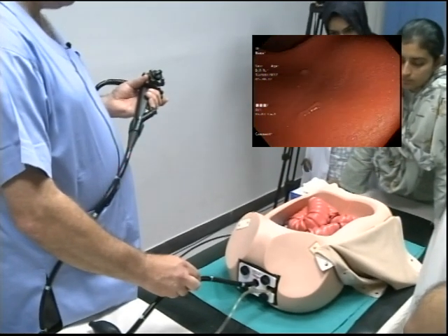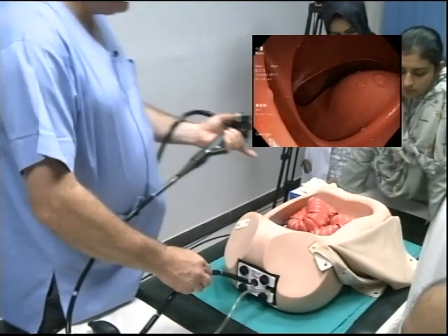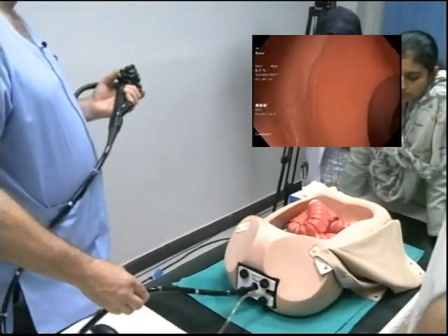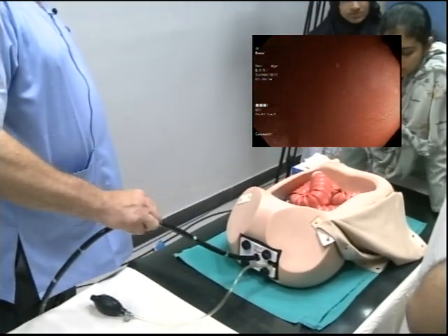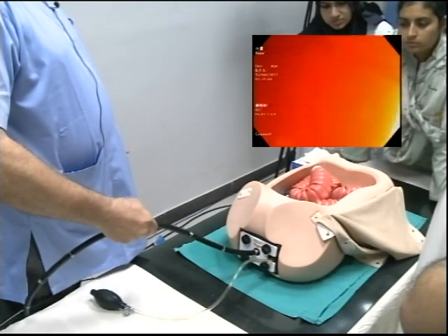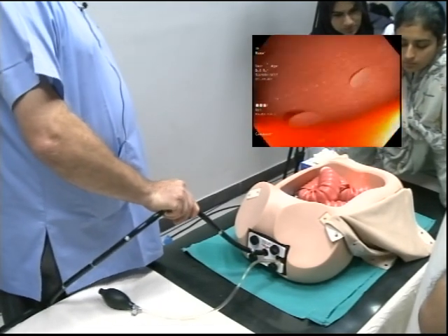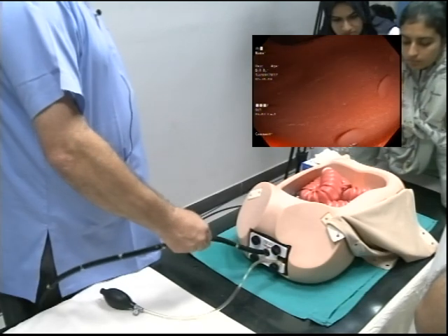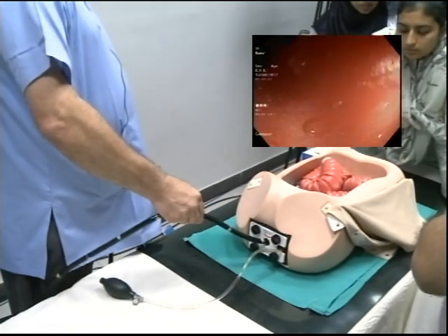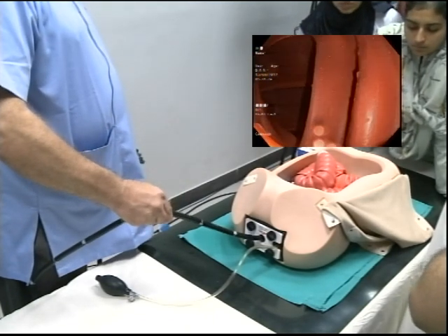If you look, see there now? Watch the scope. See it? It starts to knuckle out there, and then it starts to come here, and look at the scope pushing here, backwards, posteriorly. Yeah? If we come back, and then I get you to rotate the scope in this direction, go forward with the scope, and as it comes round the splenic flexure, it tries to bring the scope anteriorly. See it? That reduces the risk to the patient. See now it's not pushing back? And as we pull back, the scope will step forward. As it steps forward, it then lifts the mid-transverse.